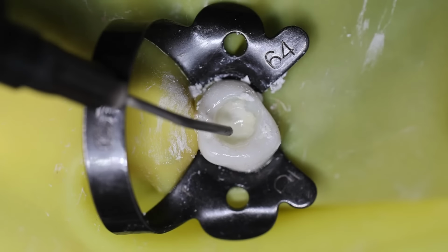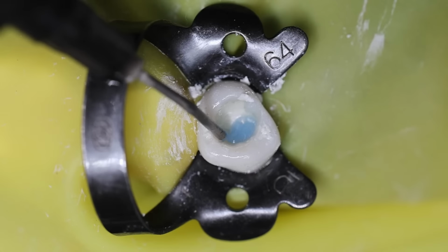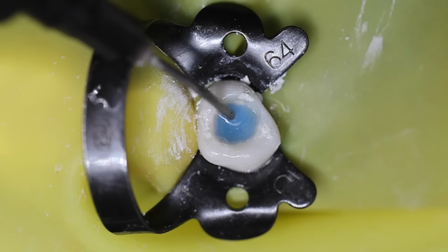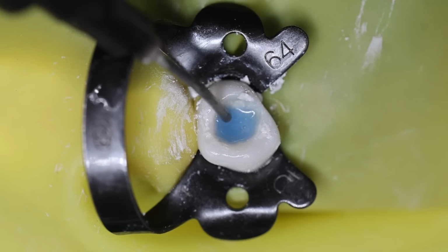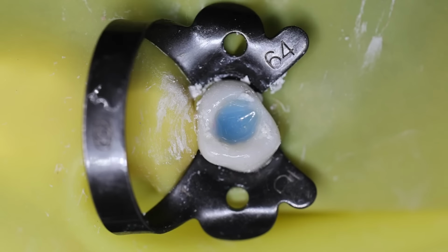Preferably now we are using a colored composite which is available in pediatric dentistry for pedo patients. So use the tip of this composite to settle the composite down, and once you see that it has settled, you can cure the initial part.